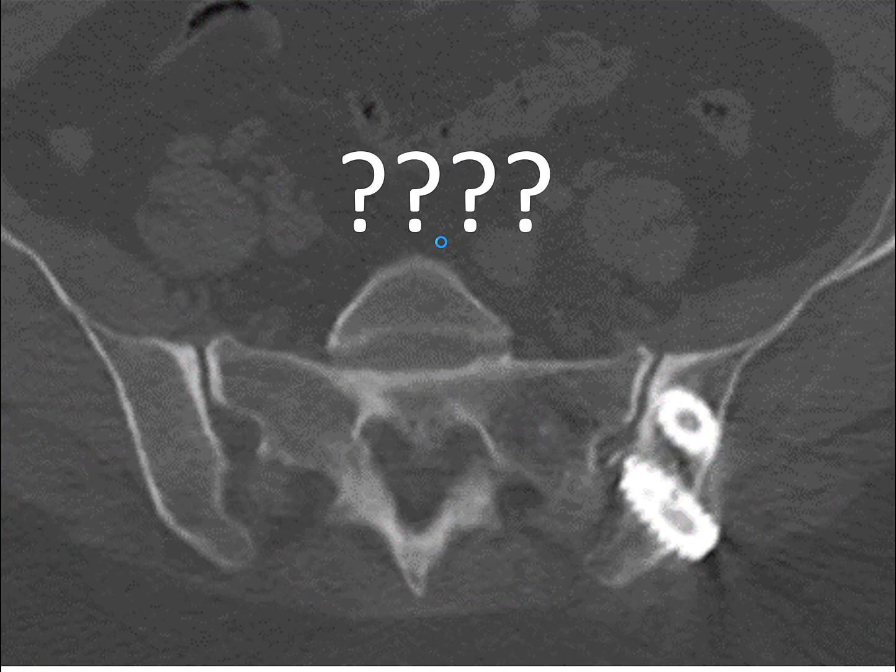I mean, if this person's in the operating room and you're taking those screws out, why not just re-instrument better? Because I probably would. If their knee was so damaged to need a knee fusion, I would probably redo the fusion. Let's stick with the SI joint, because I don't think knee is the appropriate analogy. I agree. But if you're taking these screws out, why not re-instrument the SI joint? Because I'm not so sure that was the cause of her pain in the first place.